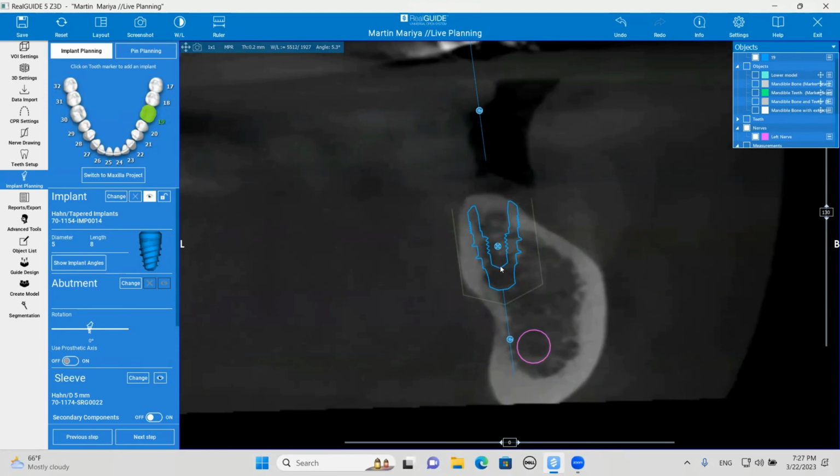So Scott, I would utilize our D3, D4 protocol on this. What that means is you're going to osteodensify it. You're going to under prep it by at least 1 to 2 burrs and then place the implant. What that will do is give you a little bit more primary stability, and it will change that D4 type of bone into a D3. So instead of drilling the bone away, you're going to laterally condense it so that we have more bone at the implant interface. Okay. Yeah, good. Thanks for bringing that up.